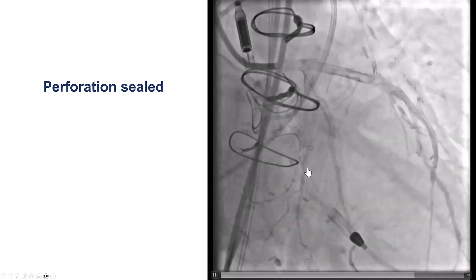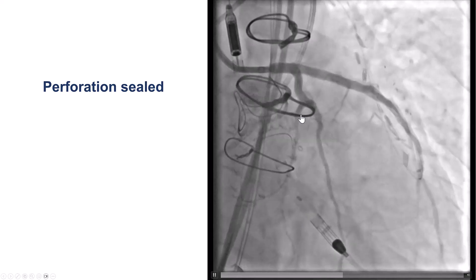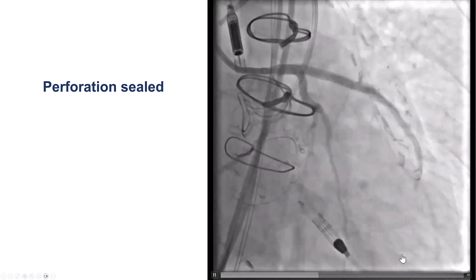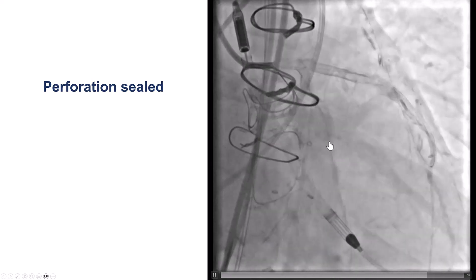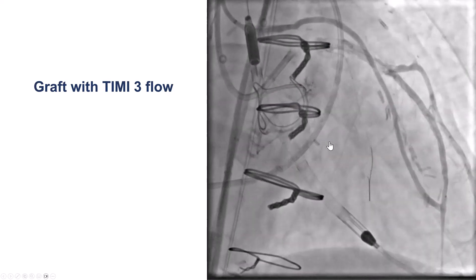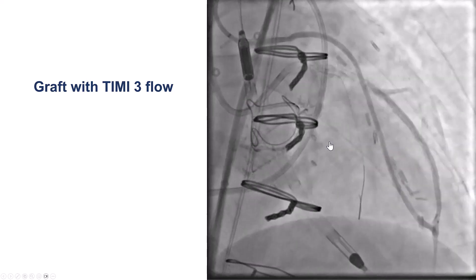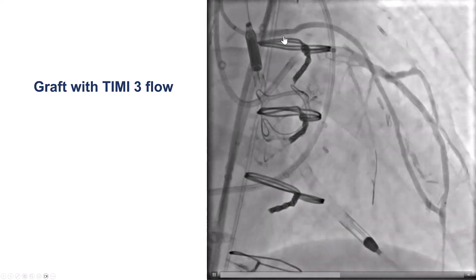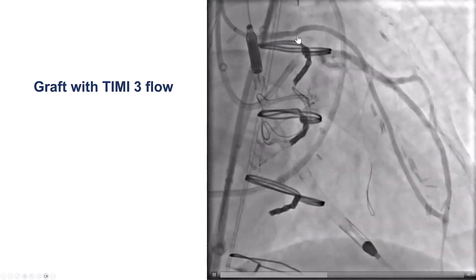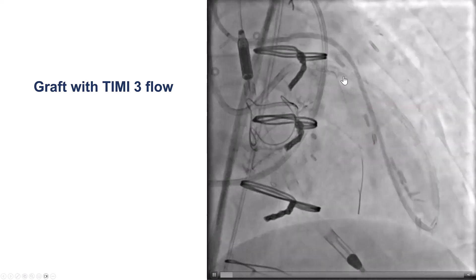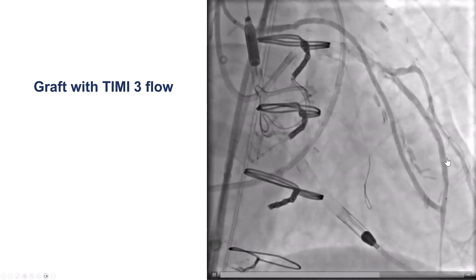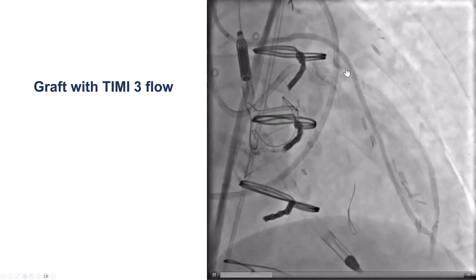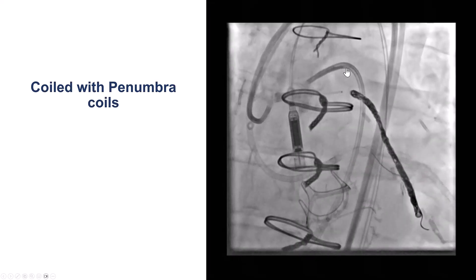Fortunately, we did not have any major diagonals or major septals in that area. Now we have a nice result with TIMI flow into the LAD and TIMI flow into the circumflex. The problem now was that we had a lot of competitive flow from the radial graft. Although this radial graft kept failing, at this point it was open and providing a lot of competitive flow. When there is much competitive flow, there is a risk of thrombosing the native vessel that was just re-canalized. So we ended up coiling it.